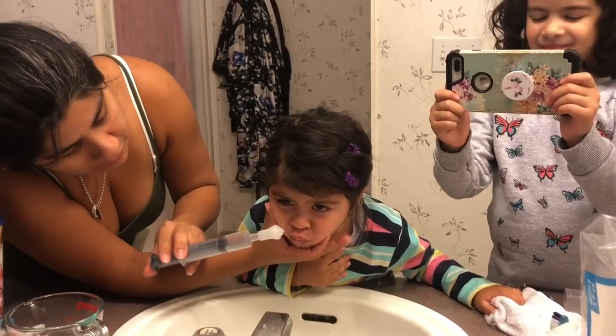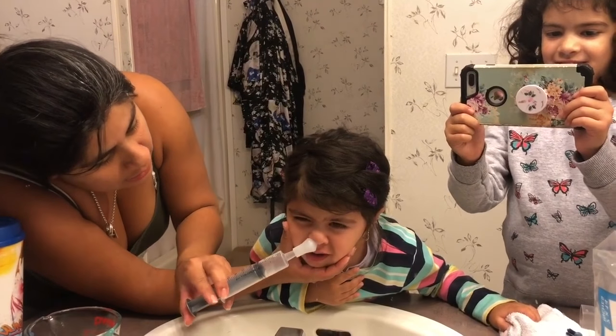Just wait. Okay, let me do it again. One, two, three.